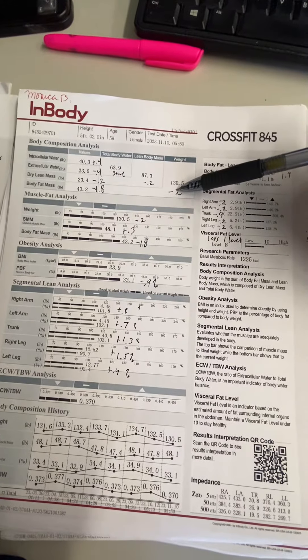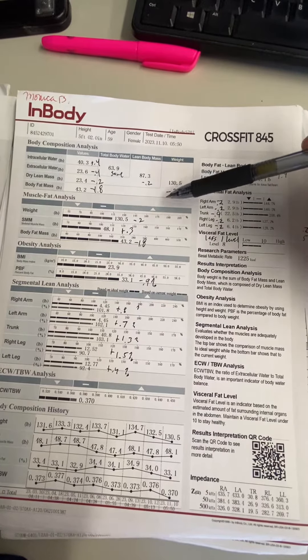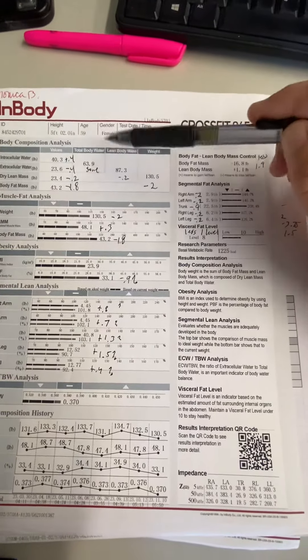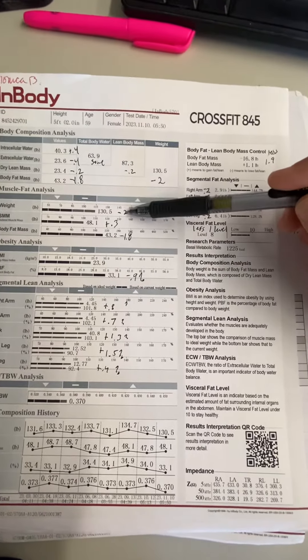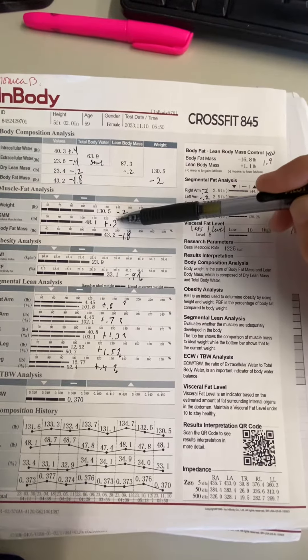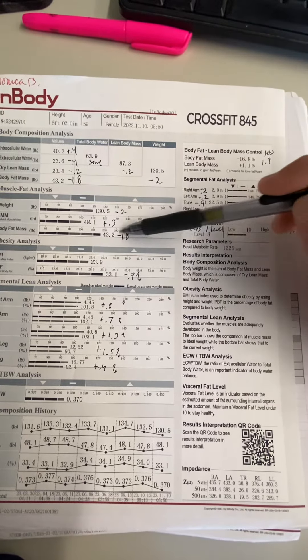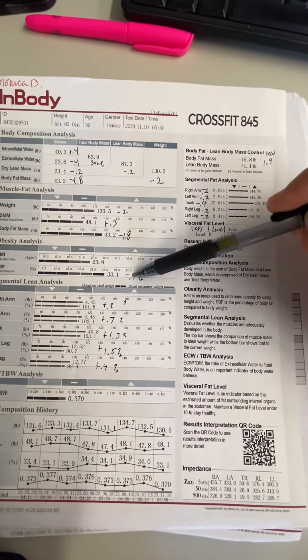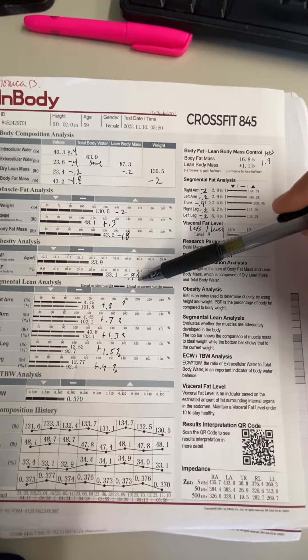So your body weight was down two pounds, mostly body fat, which is exactly what we want. You lost two pounds of body weight and gained 0.3 pounds of skeletal muscle mass, and your body fat went down 1.8 pounds. Your percent body fat decreased 0.9%, which is almost one full percent, which is great.